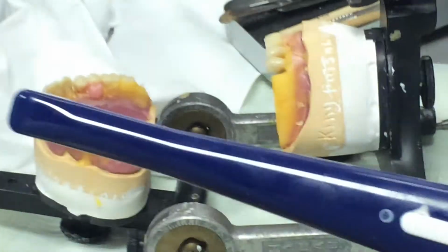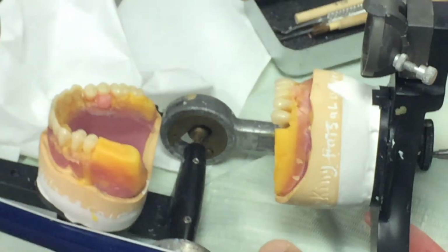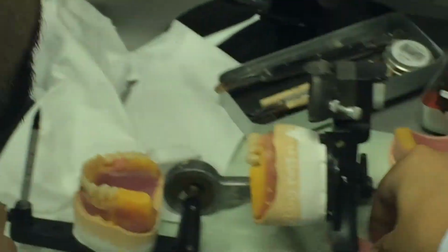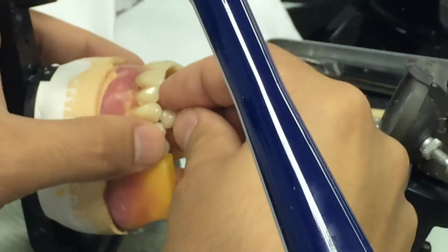Yeah. So guys, posterior teeth, as what I have done, like these two premolars, I have to follow the instruction or what I have in the book. Then that's upper. Lower, all we have to do is put them in occlusion. As what your colleague says, gonna be like this. You see? So all of it has to be on the wax.